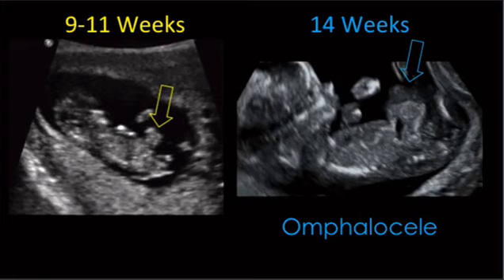and this here is the normal midgut herniation that occurs early, between 6 and 8 weeks, and sometimes you'll see it persist up to about 11 weeks. You may remember from embryology that your gut is too big to do its spinning while trapped inside a closed abdomen, so it goes out, does a turn, and then comes back in so that you're normally rotated. And that happens for everybody. Well, an omphalocele is a midline defect, and it's a herniation of gut at the base of the umbilical cord. So some things to know, just a quick refresher.